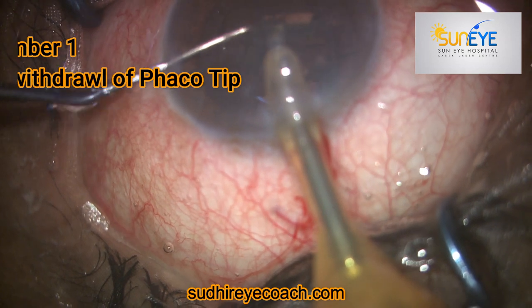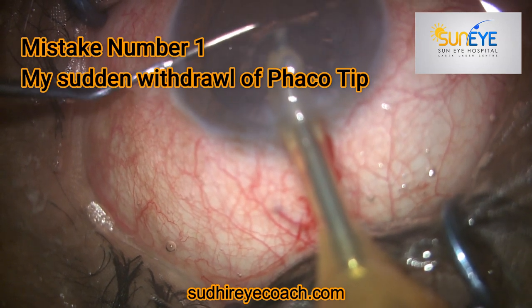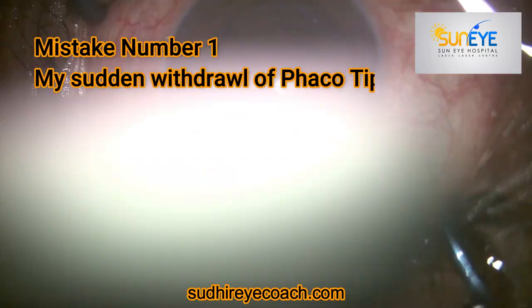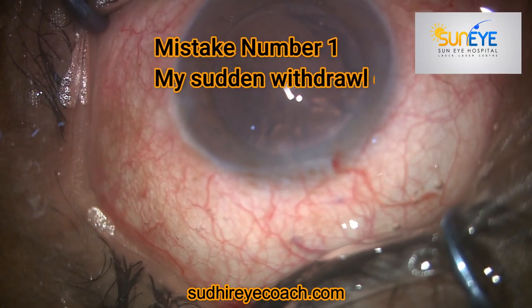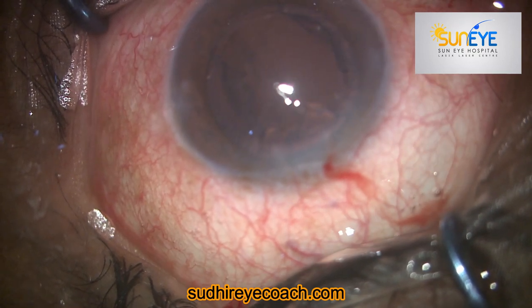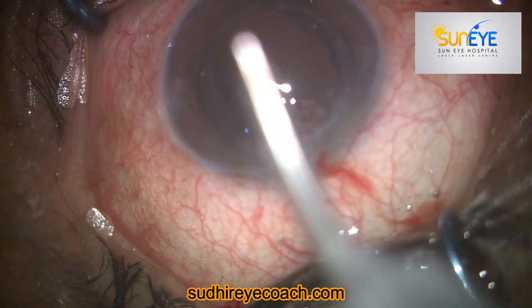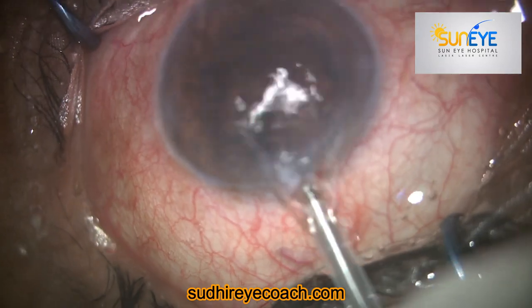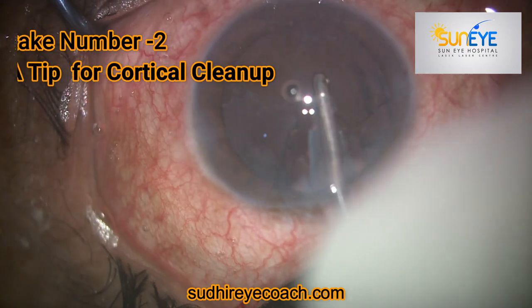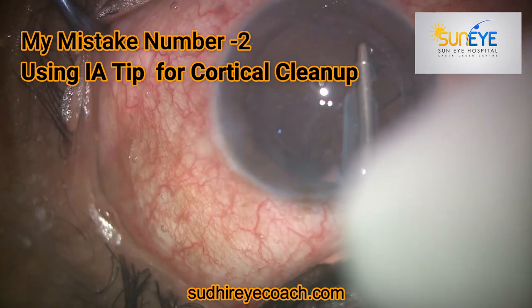Ideally, if you see any posterior capsular tear, you should try to stay in the chamber and fill the chamber with viscoelastic, so that you will get less extension of the posterior capsular tear and create less disturbance on the vitreous face.